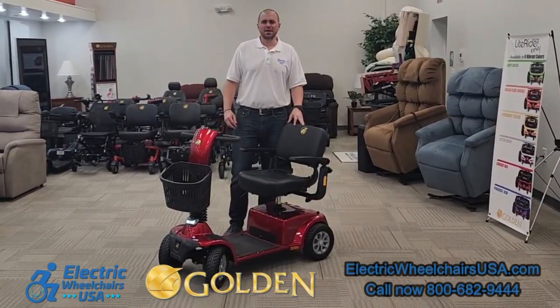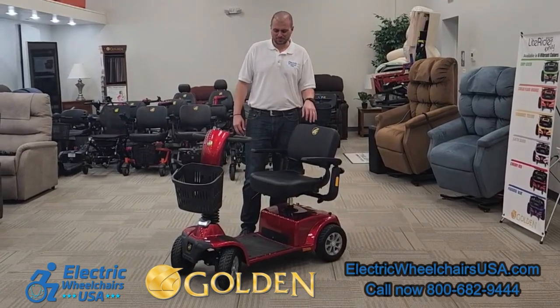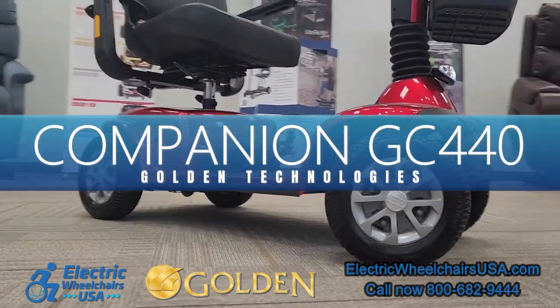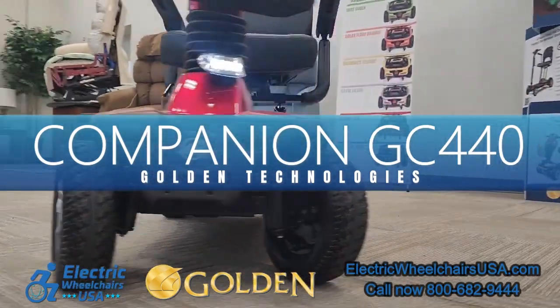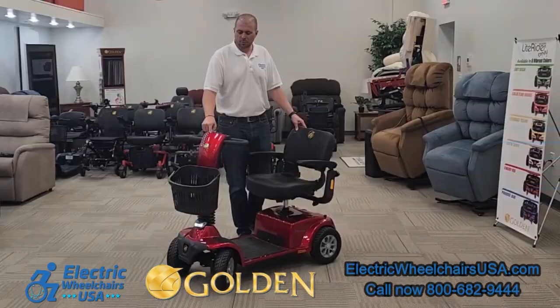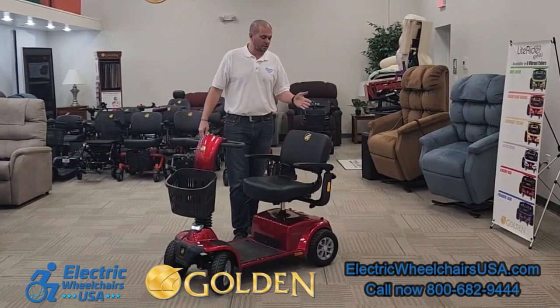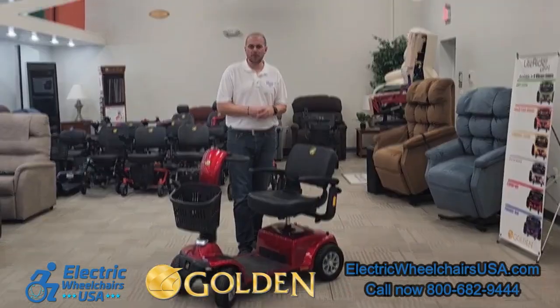Welcome to the Electric Wheelchairs USA Mobility Experts channel. In this video, we're going to go over the Companion by Golden Technologies, model number GC440. This is the four-wheel version of the Companion. It can support up to 400 pounds of weight, and there is an optional elevating seat that you can add on to this as well.